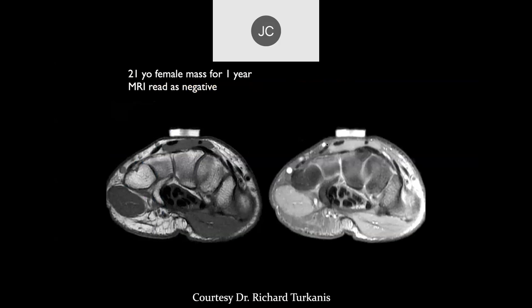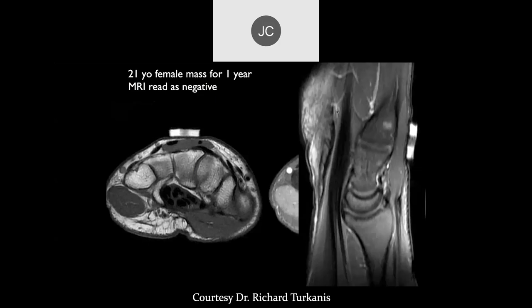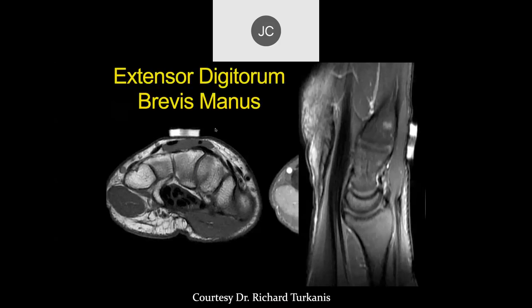21-year-old female, mass for one year, MRI read as negative. Similar to the last case — this was a local case read as a normal study, but the marker was placed right over the mass. This was an extensor digitorum brevis manus that wasn't recognized on the MR scan.